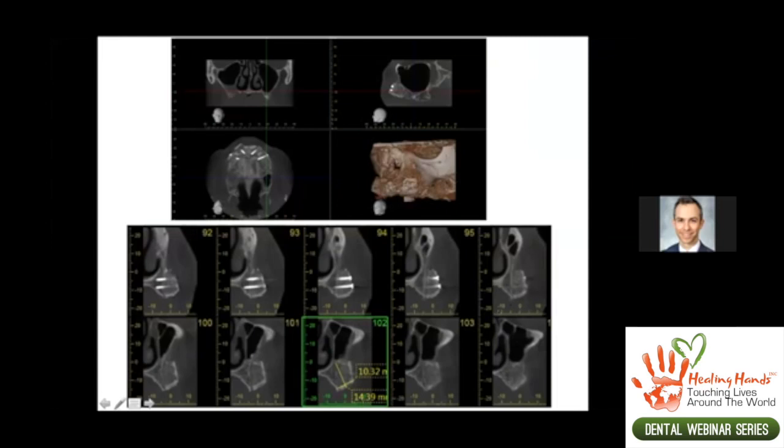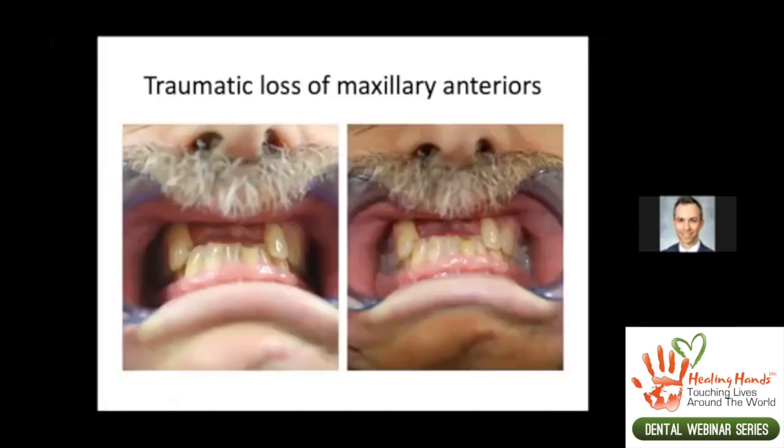Frequently after we plan the implant placement, we try to get the implant into some of the native bone in the recipient site, and obviously part of the implant is covered by the grafted bone, because remember, grafted bone can resorb gradually over time, even after placement of the implant. So we definitely want the implant to be partly in some of the native bone at the recipient site.